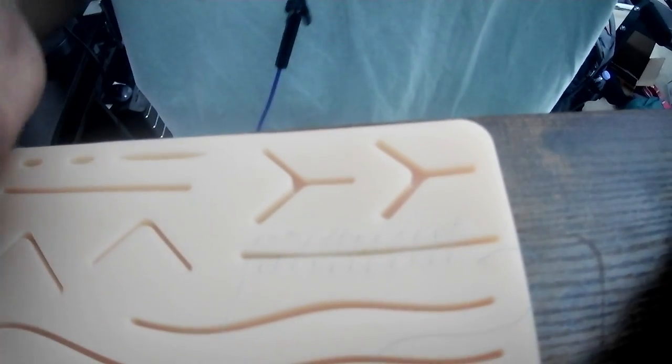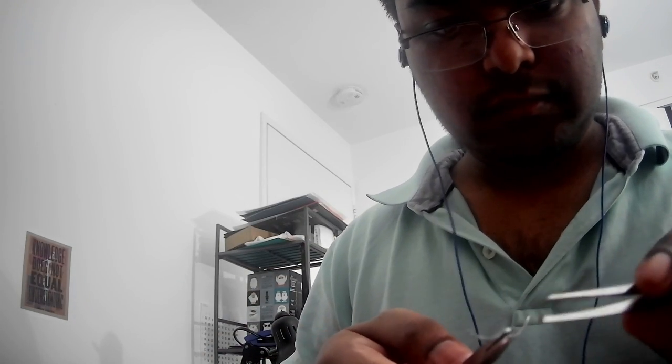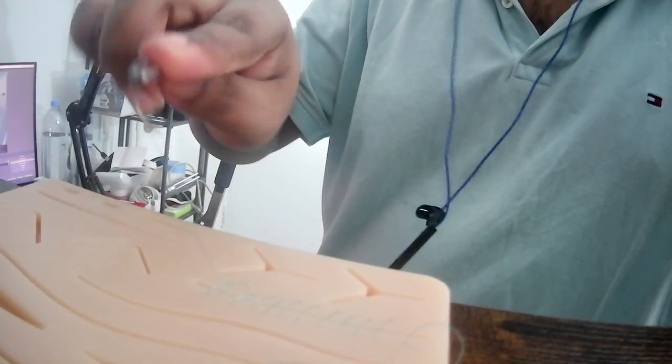Once I get the hang of that driving motion, I should be fine. Because it's a lot harder than it looks. Look at how you're holding those. Yeah, this is a lot harder than it looks. Trust me. For a beginner, at least. Here's the needle, and you hold it, right? And you hold it. You gotta do this kind of motion across the wound.